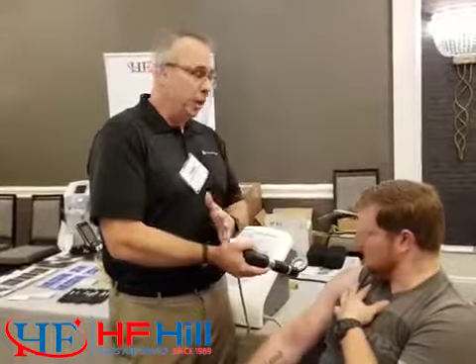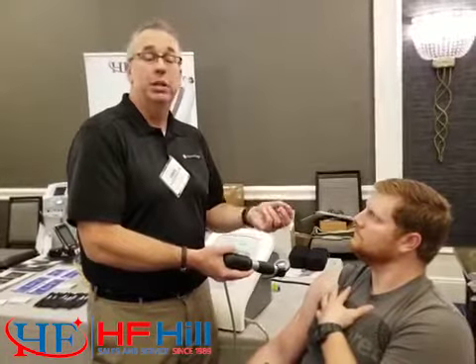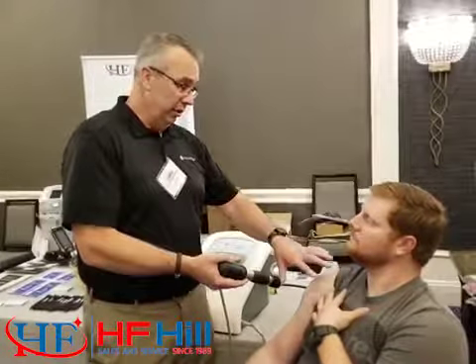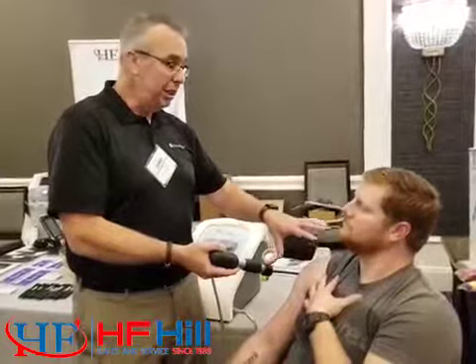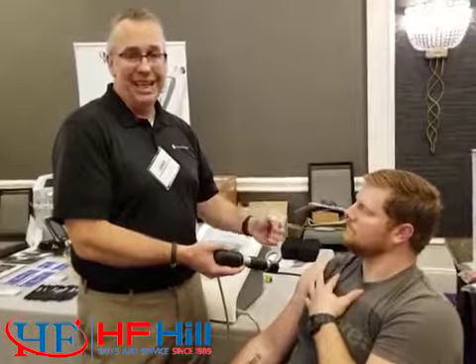It's a misnomer that we're creating a new injury. We're not creating a new injury, we're actually just trying to insult the tissue to instigate a new healing process, which is different than an injury. We don't want to cause inflammation. That's actually a side effect. So it's normal that there's a certain amount of petechiae or redness in the area, but it shouldn't create a whole lot of achiness or swelling. That usually means we probably went too hard, too far.